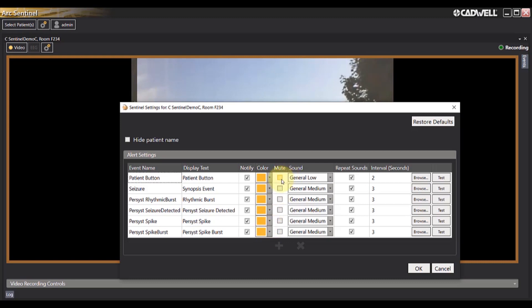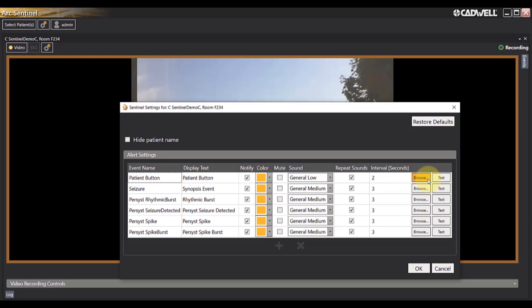You can also choose to mute sound and what the sound volume is in general for each notification type. You can choose an interval in seconds between notifications, and you can browse and test each sound notification for each event type.